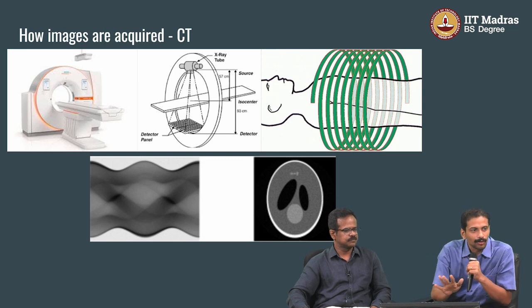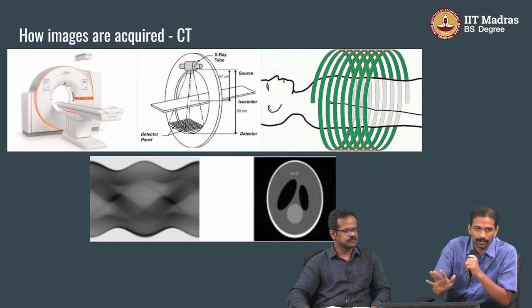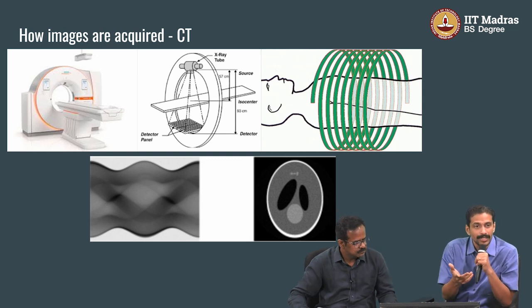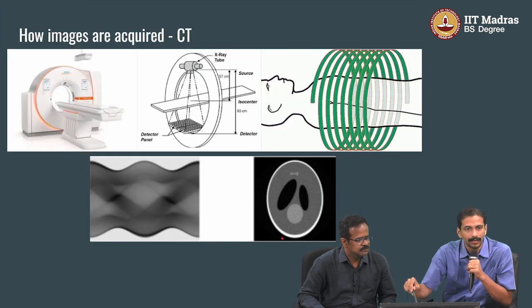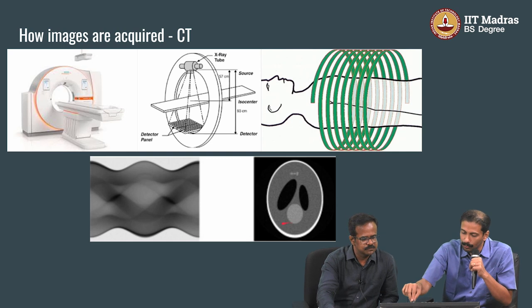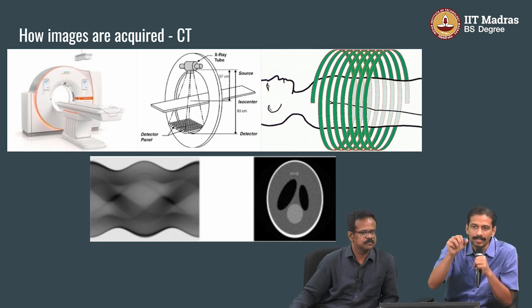That is what the cross-sectional modality means. That's the meaning of cross-sectional modality. CT is a cross-sectional modality, right? And so what is the benefit of CT? Like I said, if this is the front of head and this is the back of head, this is the right side and this is the left side. If anything is located here, I know that it is located somewhere in the anterior part. If it is located posteriorly, we can say that it is located in the posterior part. So you get that localization information.